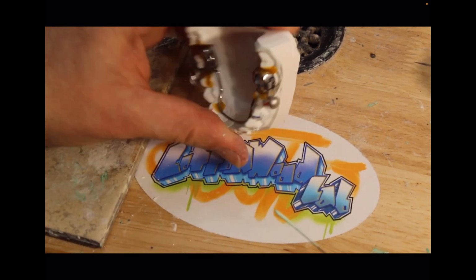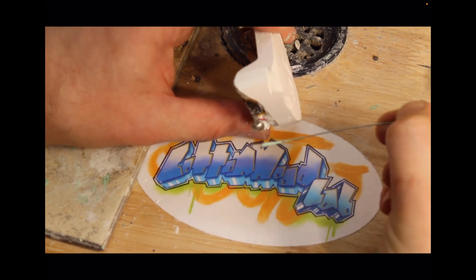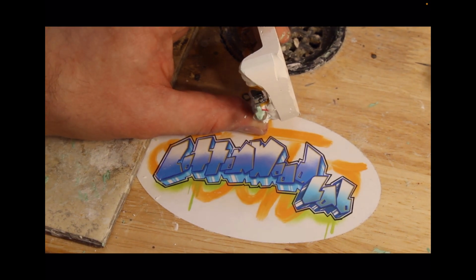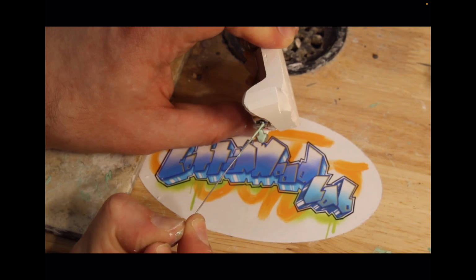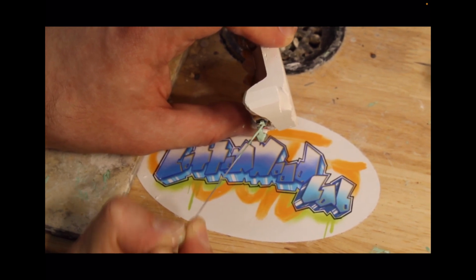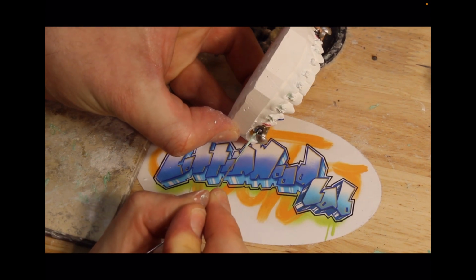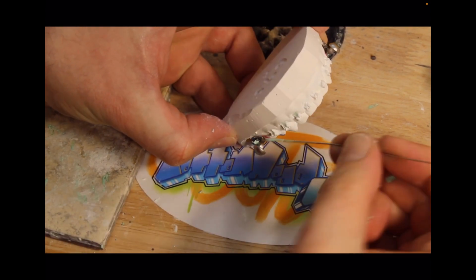And then if you notice here, we're going to really focus on how we add the anti-flux to the cams. You want to make sure you don't get anything on the distal of that cam because that can change your advancement. Once again, we're just going to go in and add some anti-flux into the tubes and the hooks. And then you'll see here we're going to flip it and also get some anti-flux on the tissue side of that cam to ensure that no solder glops up and inhibits that archwire tube from being accessed, okay?